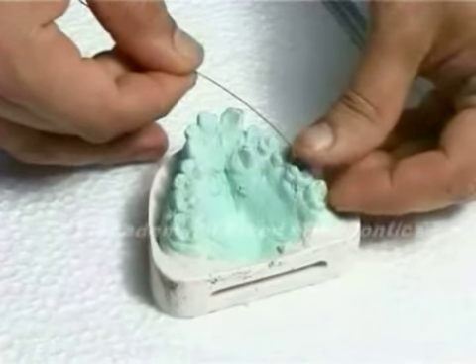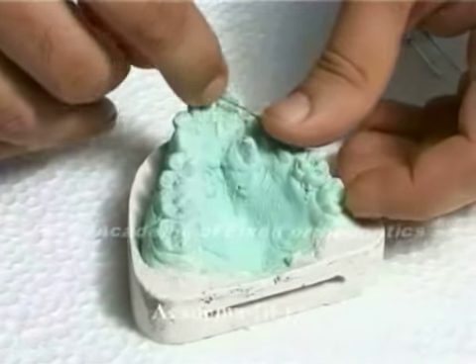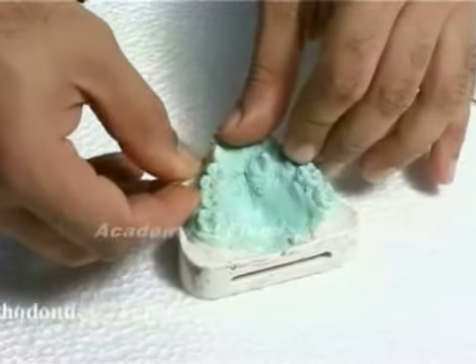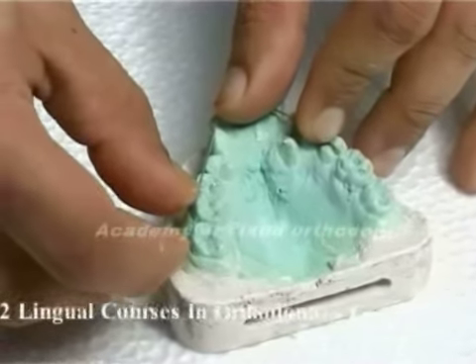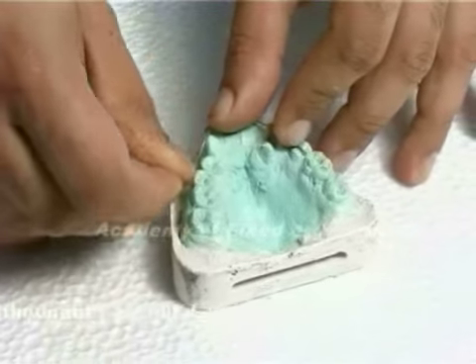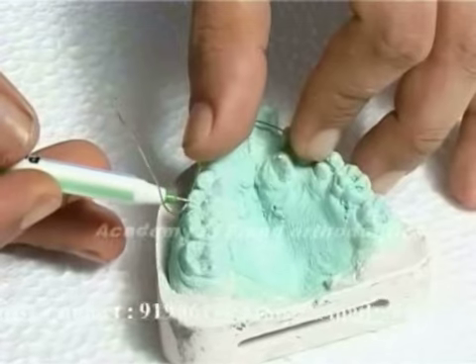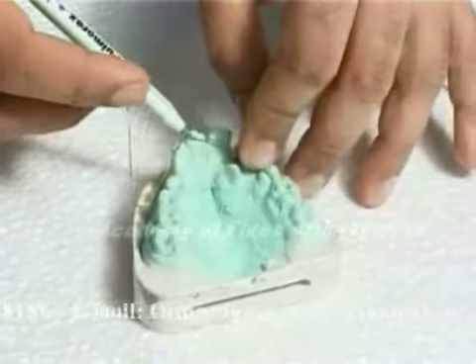This is called the Carey's analysis in the lower, and the arch perimeter analysis in the upper. Take a 24 or 26 SWG brass wire and take it through the mesial side of one molar to the mesial side of the other molar, passing through the buccal and the incisal edges of all the anterior teeth — all the teeth anterior to the first molar. Mark the ends and straighten the wire.